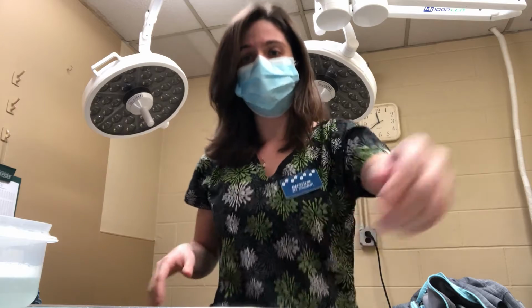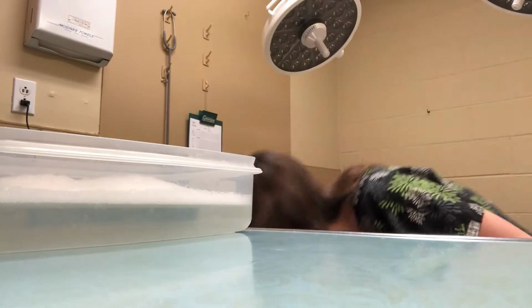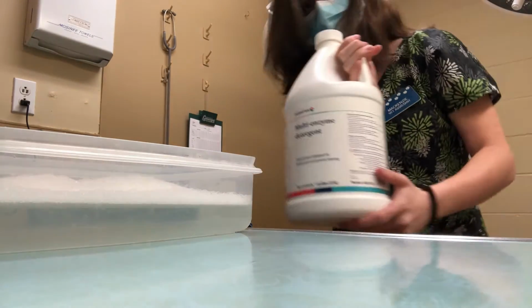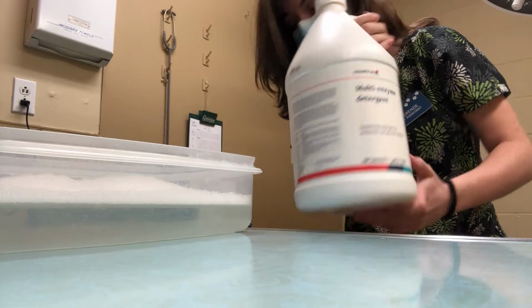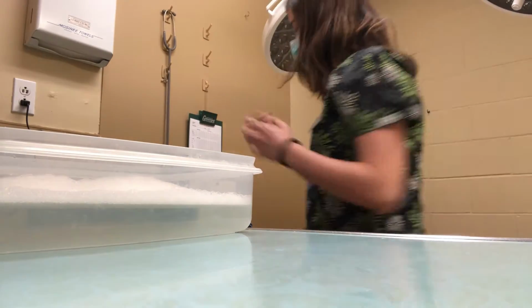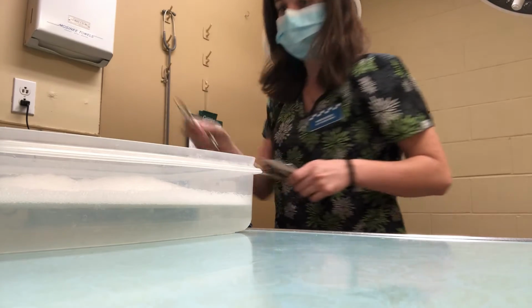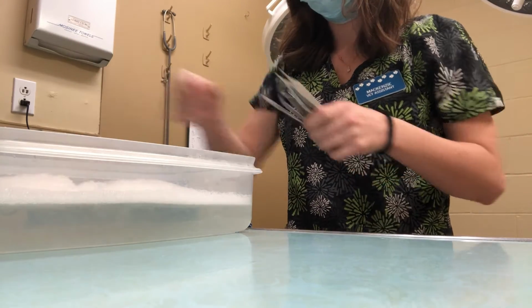So first thing we're going to do, I have my distilled water along with our cleaning detergent right here. So I use it for enzymes. And this is our pre-soaking, so basically it's just to make sure that any debris and blood does not dry onto the instruments.